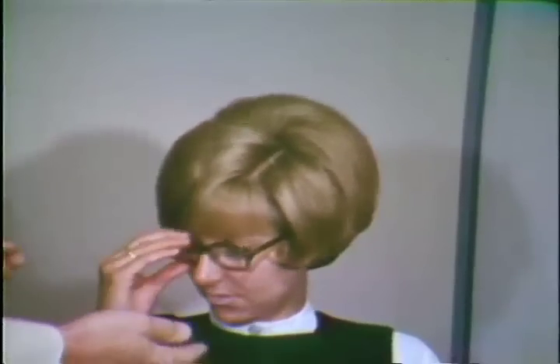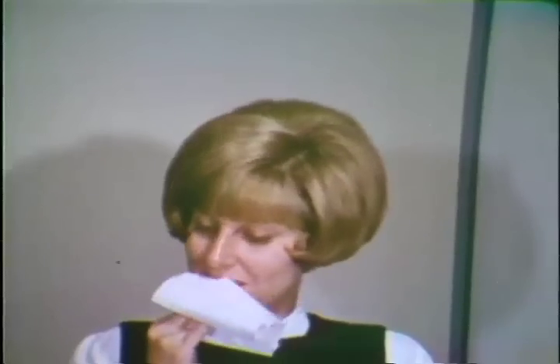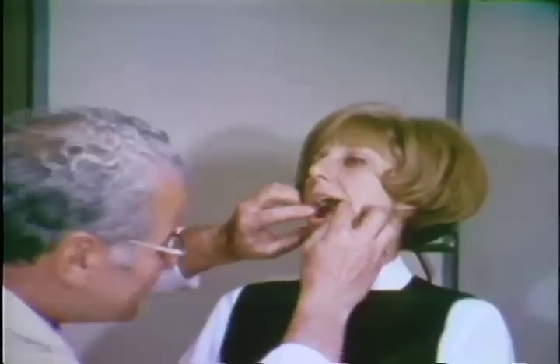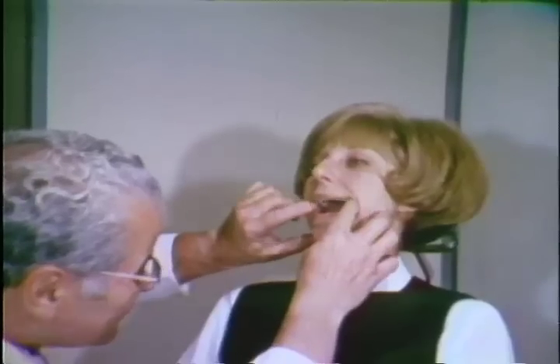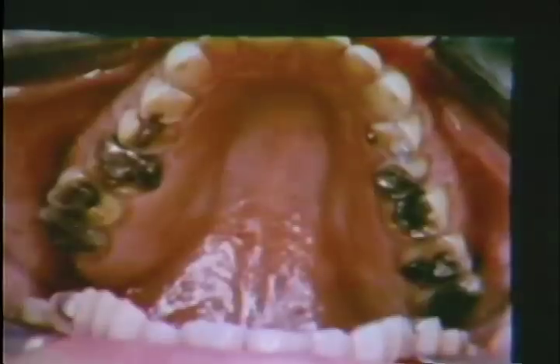The patient is seated in the chair and the headrest adjusted. As in all dental radiographic techniques, the patient is asked to remove eyeglasses and, in the case of a woman, her lipstick. Any removable dental appliances should likewise be removed at this time. The oral cavity should then be examined for any obstacles to the placement of film and the number, placement, and alignment of teeth.